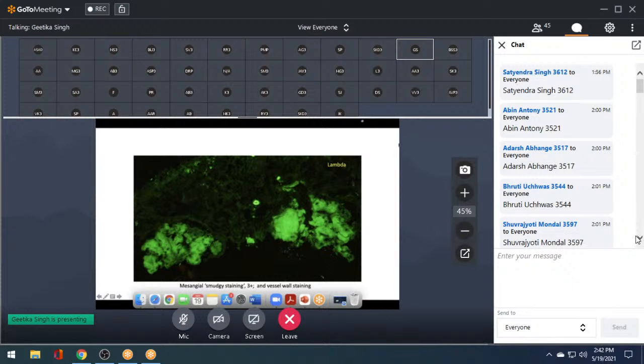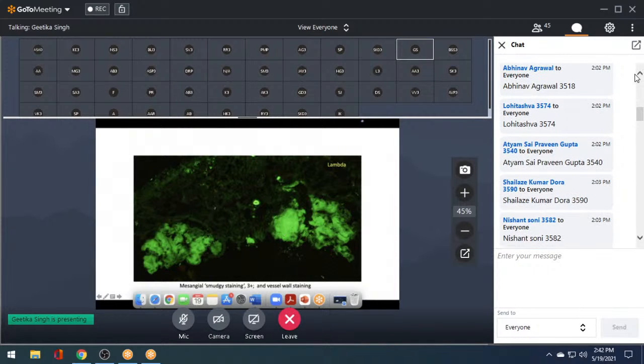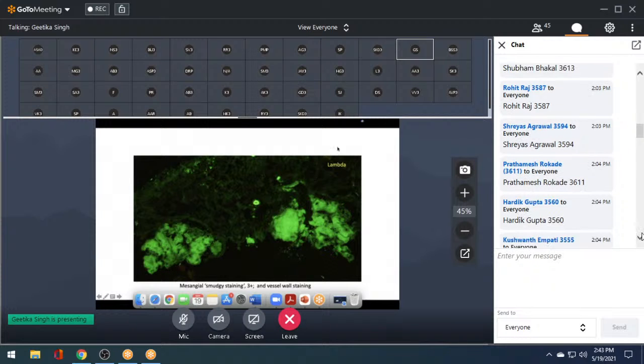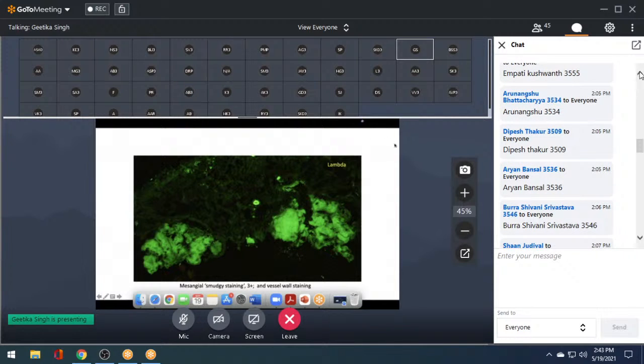This is a very common disease which will affect the kidney. This is a, let's say, 70-year-old patient who presents with, let's see, maybe bone fractures. And you look at their kidney biopsy and you see some smudgy eosinophilic material. And you run an immunofluorescence and you see that this material, which is in the glomeruli, so you can make out the glomerulus, stains only for lambda. It doesn't stain for kappa. Okay? And I can also see the material in the vessel wall. Can anybody guess what's the diagnosis?